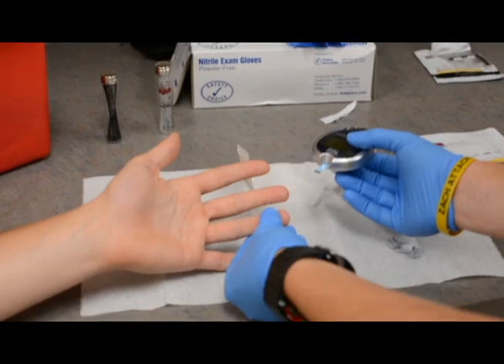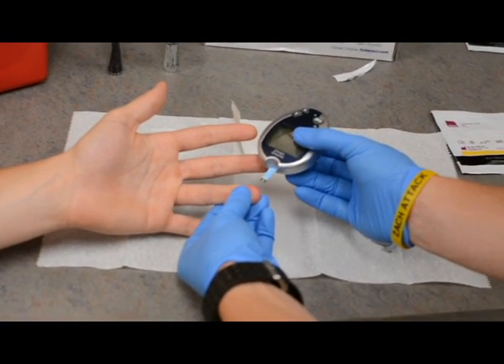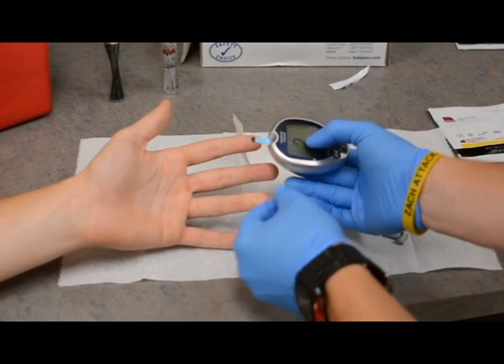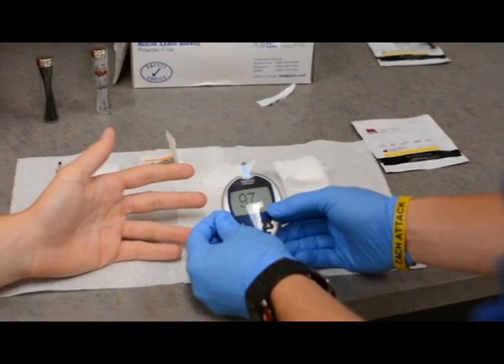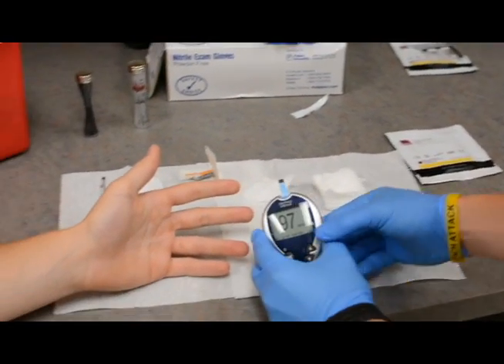What you're going to do is hold your subject's finger with the blood droplet on the end, and you're going to place the test strip at a perpendicular angle to that droplet. This is going to ensure that the blood sample gets pulled into the capillary tube that is actually in the test strip.